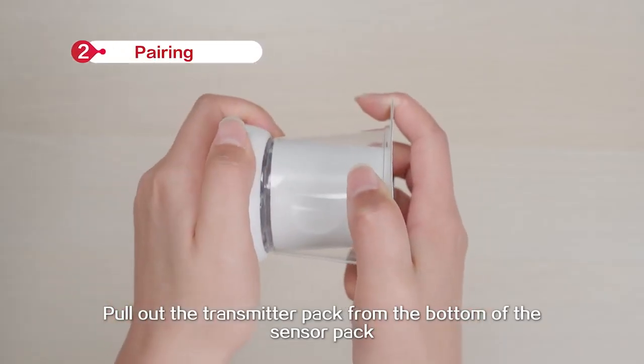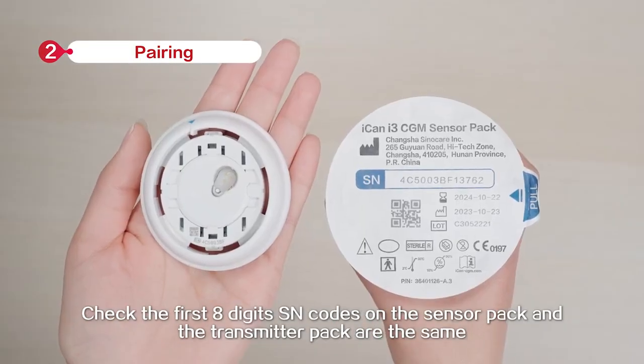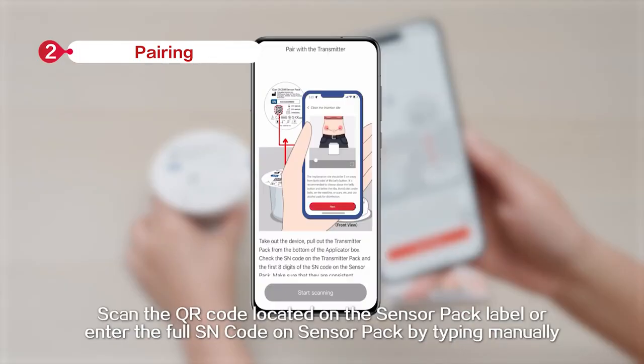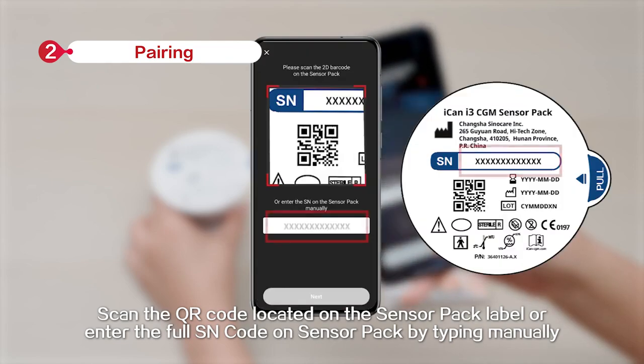Pull out the transmitter pack from the bottom of the sensor pack. Check that the first 8 digits of the SN codes on the sensor pack and the transmitter pack are the same. Scan the QR code located on the sensor pack label, or enter the full SN code on the sensor pack by typing manually.